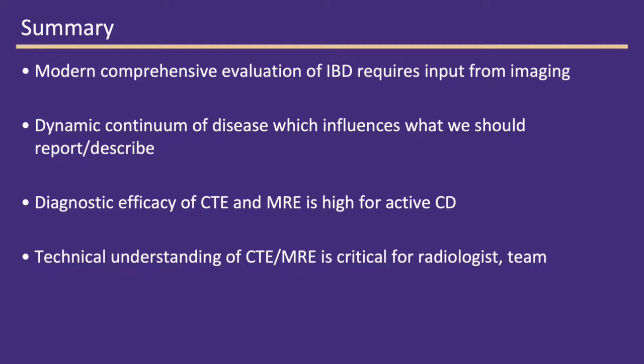Imaging is highly accurate for patients with active disease, and the protocols have become relatively streamlined and standardized now, such that any abdominal imager should be familiar with both techniques and when to use MR versus CT.